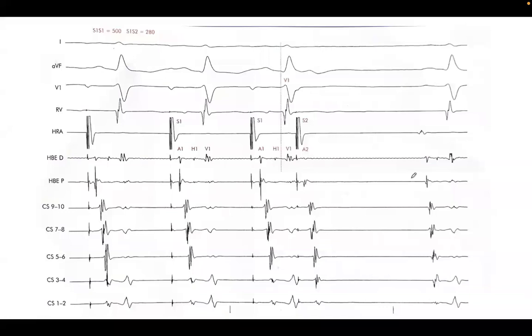Now we're coming down S2s, and then eventually you will see what do we see here? What is this? What is block where? No, wait, sorry. V? Block, yeah, and you're capturing the A, but you blocked at the V. Do you see His? Well, you don't see His, and you know that you should see His nicely, but here you don't.